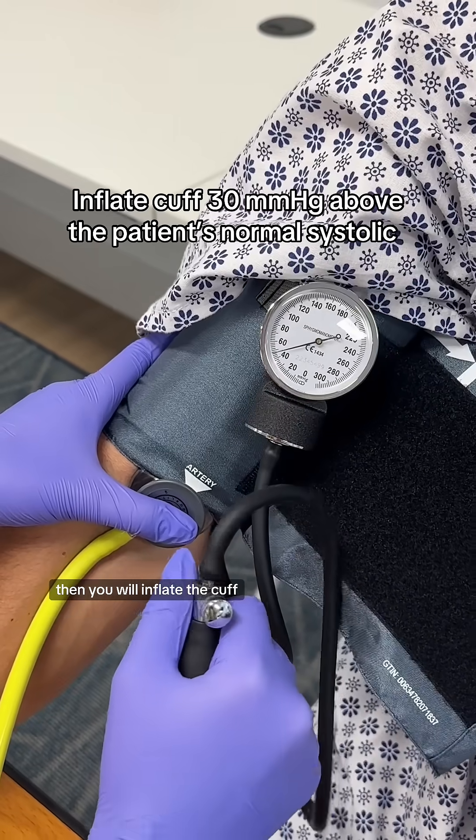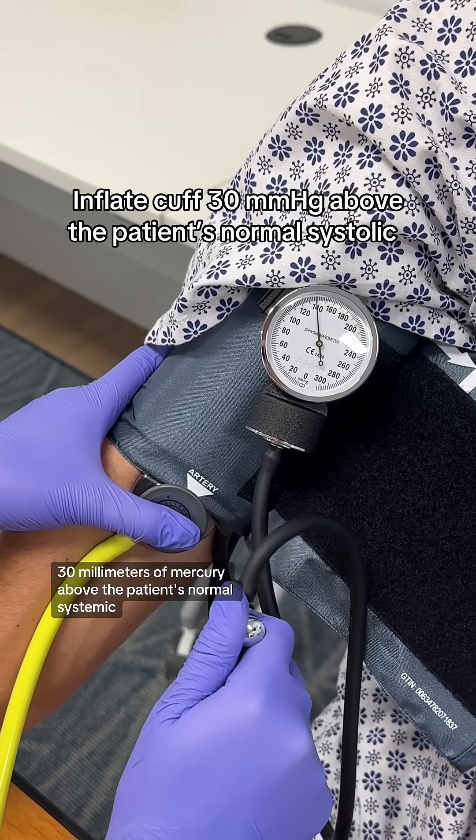Then you will inflate the cuff 30 millimeters of mercury above the patient's normal systolic.